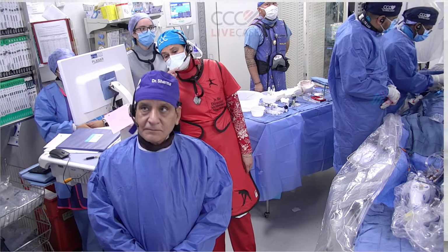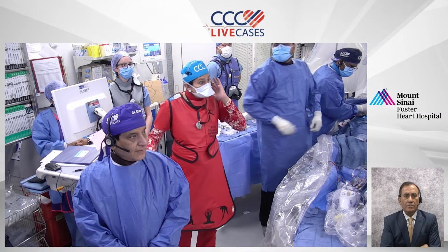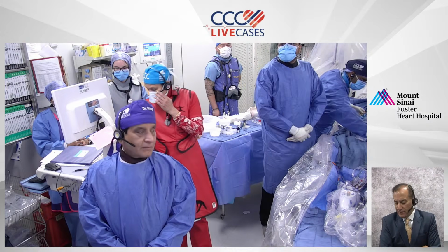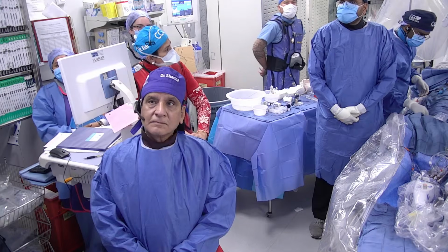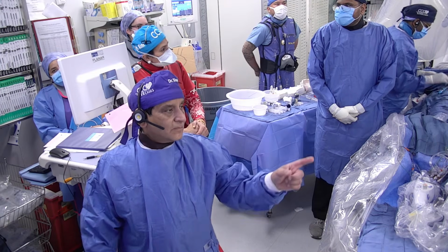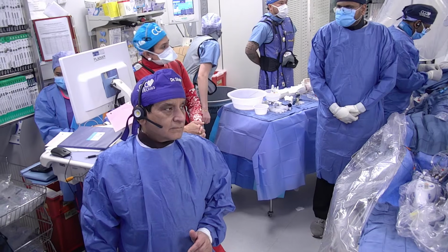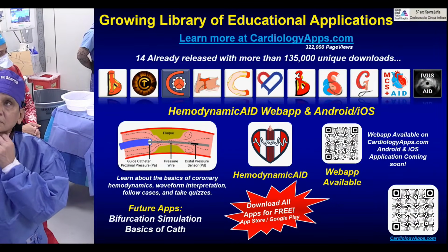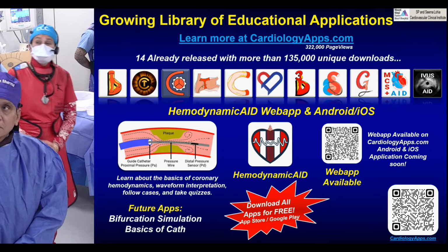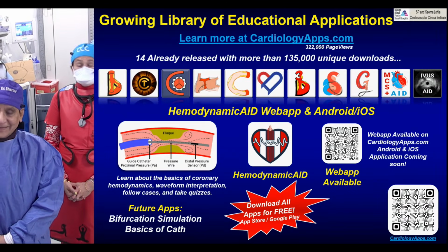Anu, final comments by you? No, I think, can I see? You can hear me? Yes, we can. Okay. No, I think the goal is teaching management of calcium and bifurcation. So we try to teach some new points that we have learned using atherectomy and IVL. And there is the educational apps there.